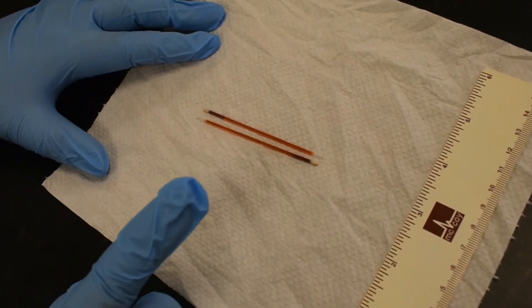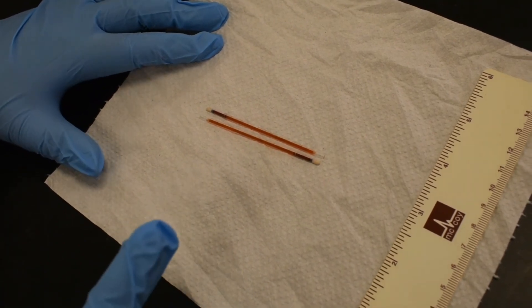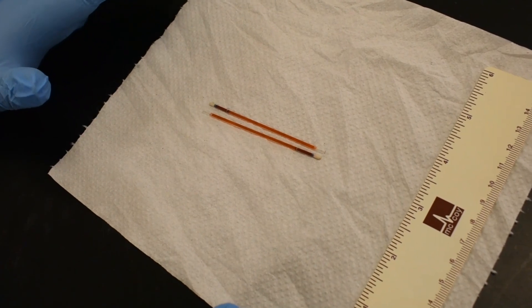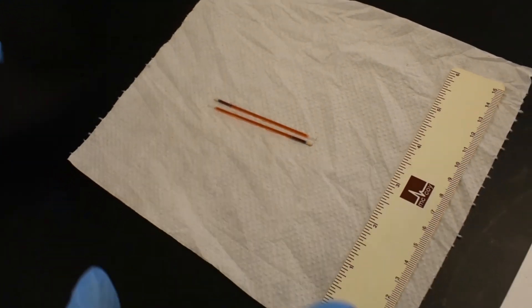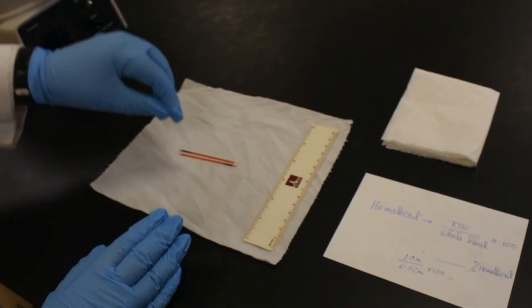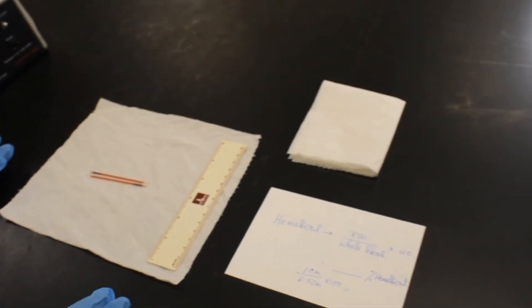Once you are done with your calculation with the sample, always go back and compare the value with the normal male versus female. And after you are done, do not forget to clean up. Throw away the samples with blood in the biohazard container and also clean up the area where you have worked.